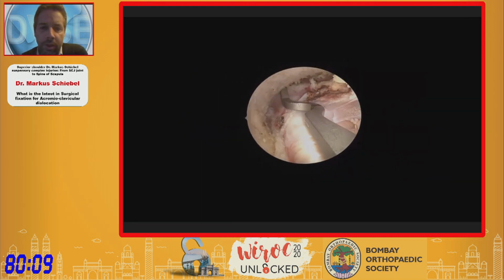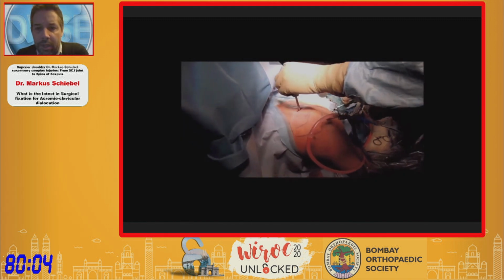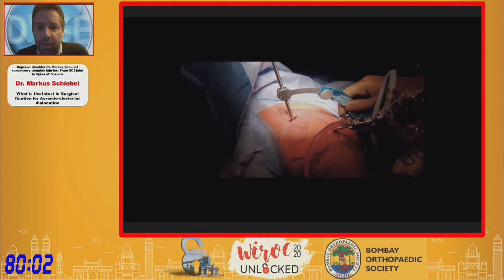We look from lateral via a transtendinous portal. We go in with an aiming device, as you can see here.